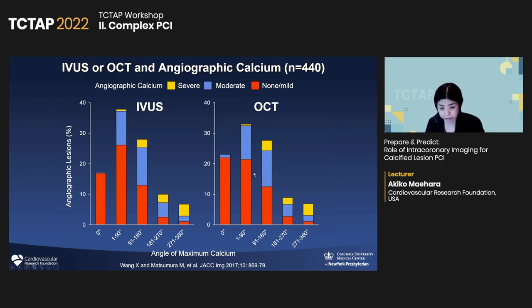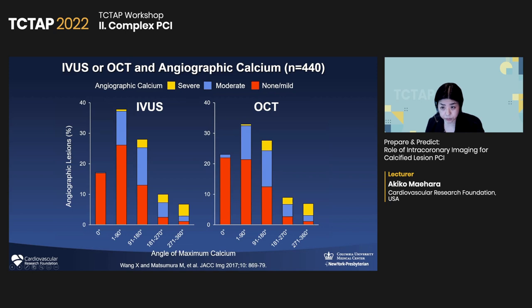Laser atherectomy was performed after making a big calcium fracture behind the stent, finally achieving good stent expansion. But as Ajay mentioned, we should avoid this type of issue at the time of in-stent restenosis and make a perfect job at the index procedure. So let me start with the angiographic appearance in correlation with IVUS and OCT. In general, if you see very severe or moderate calcium by angio, we see large calcium by either IVUS and OCT. But it's also important to understand there is calcium we couldn't see by angio that we could see only by IVUS and OCT.